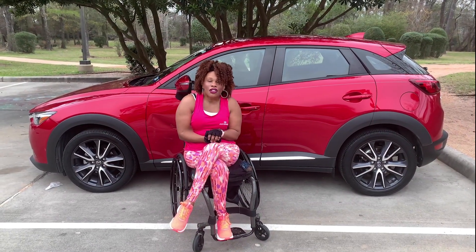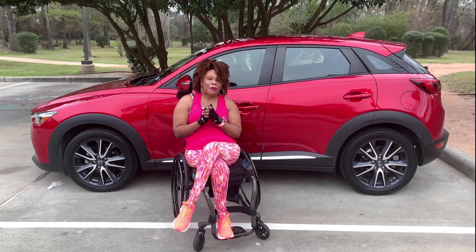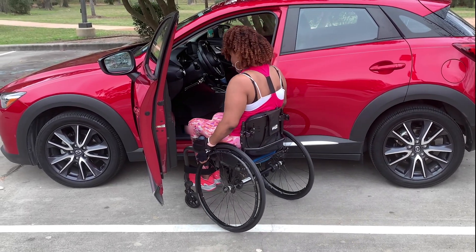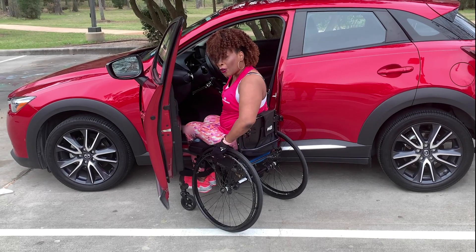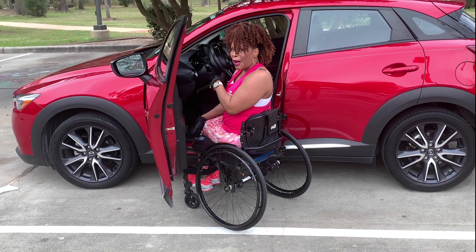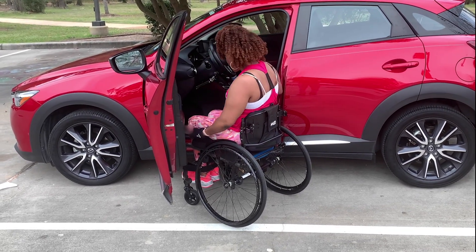So I'm going to show you guys today exactly how I drive, how I get in and out of my car, and how I get my wheelchair in and out of my car. Typically when I get ready to get into the car, I normally put my chair at an angle. That way when I'm transitioning from my chair to my car, I'm not rubbing my body against the wheels, and it just makes it a little bit easier.